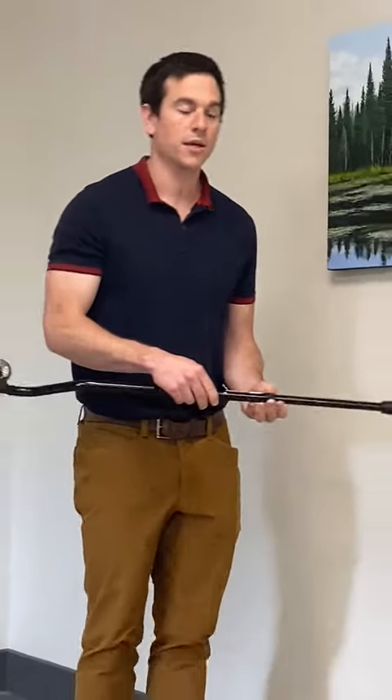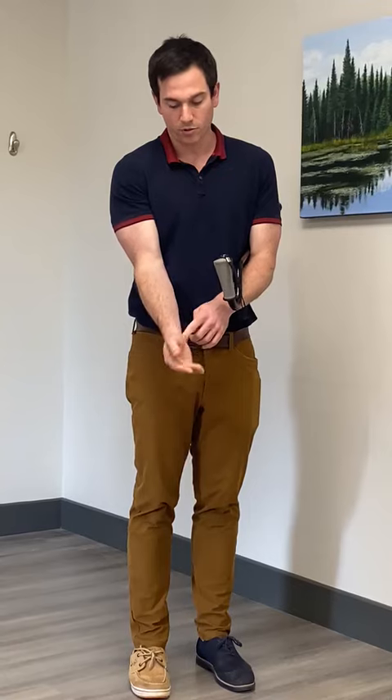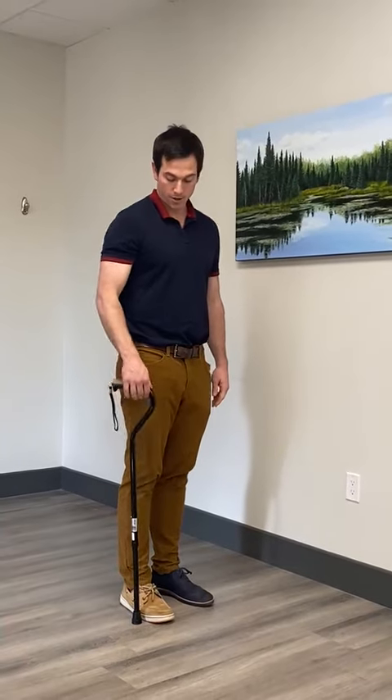Typically the way that you want to size a cane for most people's height is to look at where your wrist bends. Sometimes we have a few little wrinkles there, either on the front or the back — look at where it bends. And then if you're standing up to your normal full height, right where your wrist bends should be where the bend in the cane, or the handle of the cane, is.